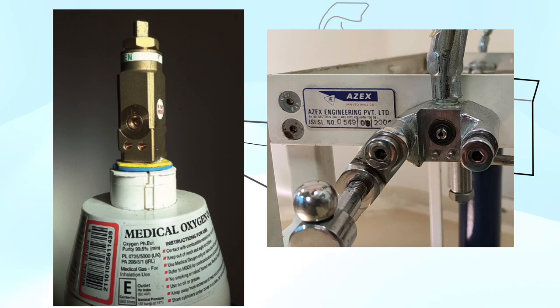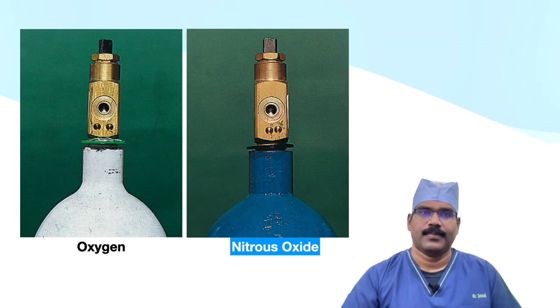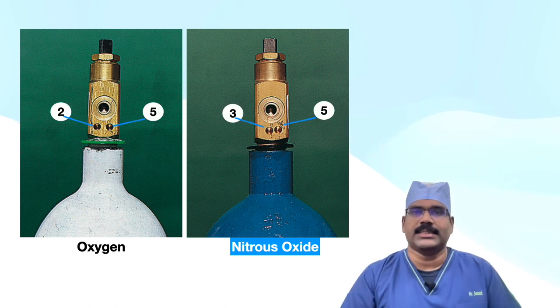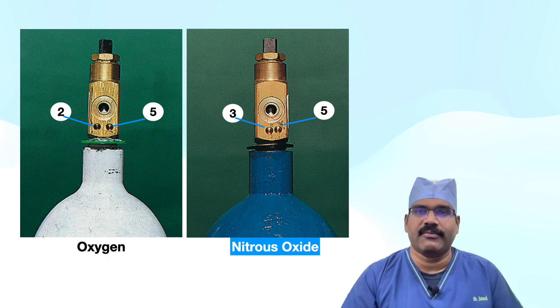Here you can find index pins on the hanger yoke and index pin holes on the oxygen cylinder valve. The pin index is stated as 2-5 for oxygen. The pin index system also prevents charging with the wrong gas, as the gas suppliers use the same non-interconnectable system for their filling connections. Here you can appreciate different index pin-hole positions in oxygen and nitrous oxide cylinder valves — you cannot mount an oxygen cylinder to a nitrous oxide hanger yoke and vice versa.